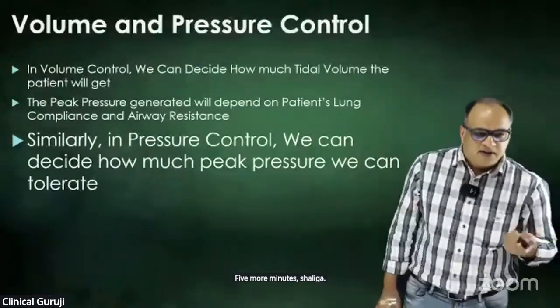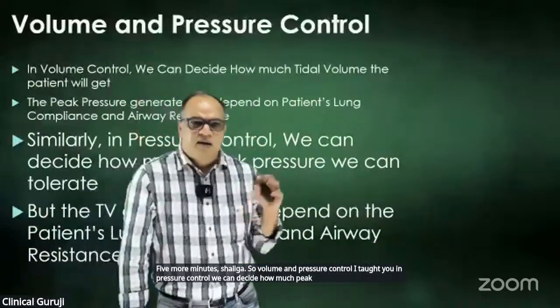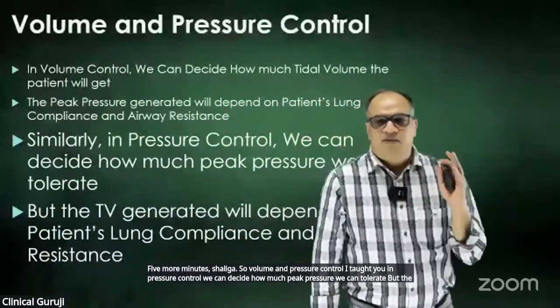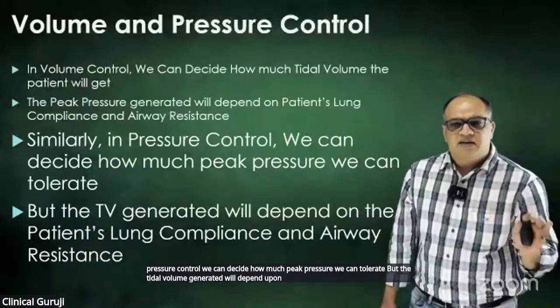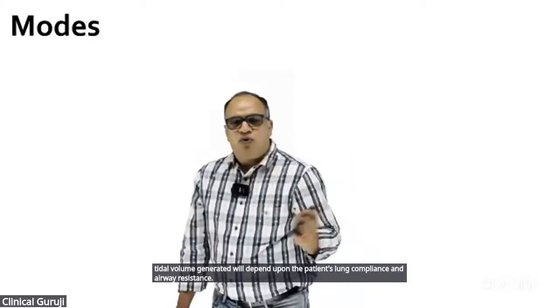So volume and pressure control I taught you. In pressure control, we can decide how much peak pressure we can tolerate, but the tidal volume generated will depend upon the patient's lung compliance and airway resistance. Right. So one more mode I have to teach.